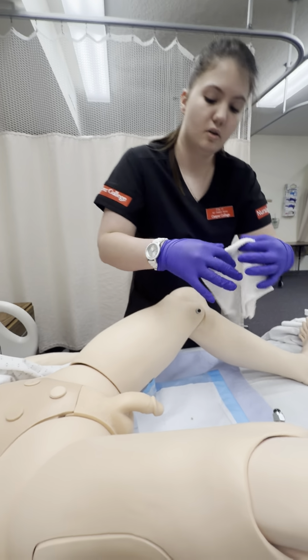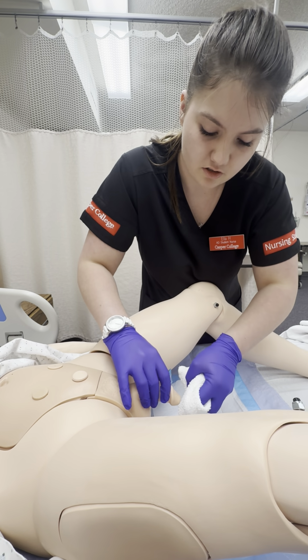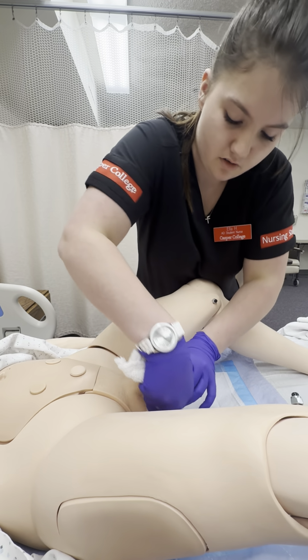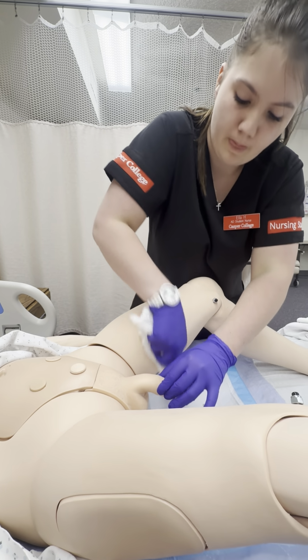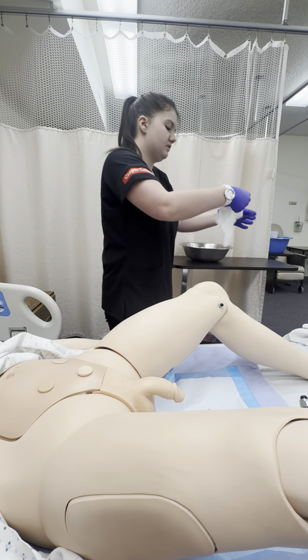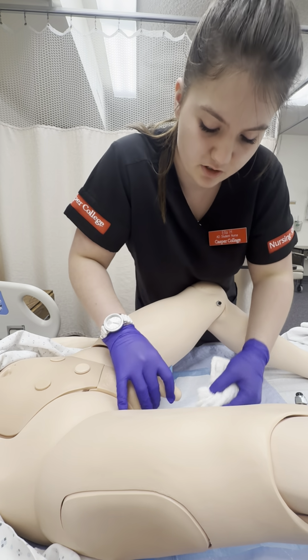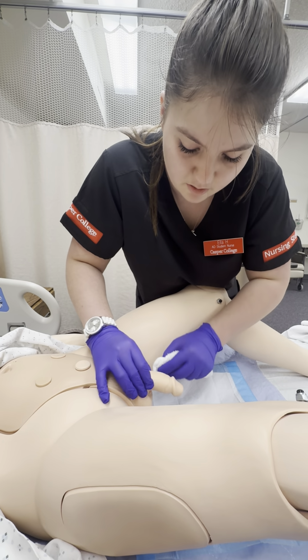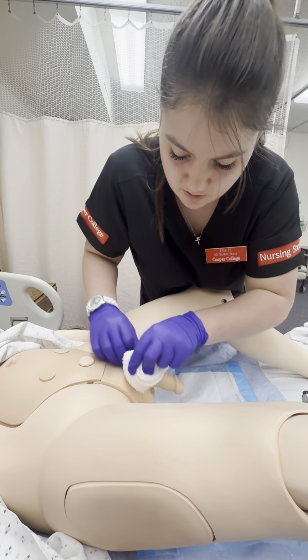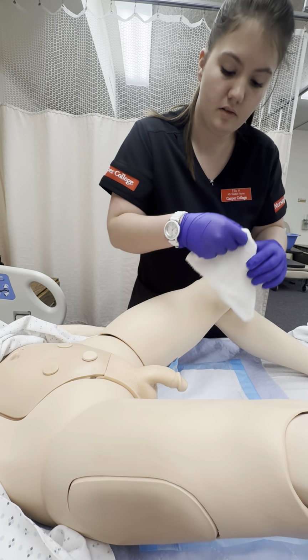All right, and I'm just going to use a washcloth. We're gonna use some wet soapy water, and we're gonna go just around here, going from the top. Alright, now we're gonna rinse, once again starting at the top and working our way down, making sure not to contaminate. And then we'll dry as well.